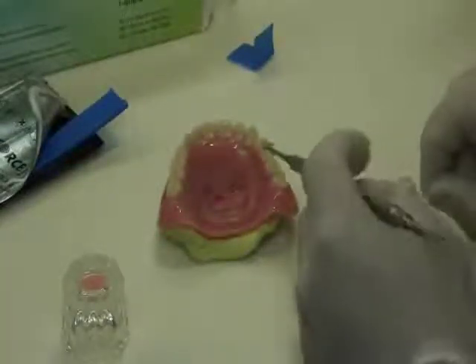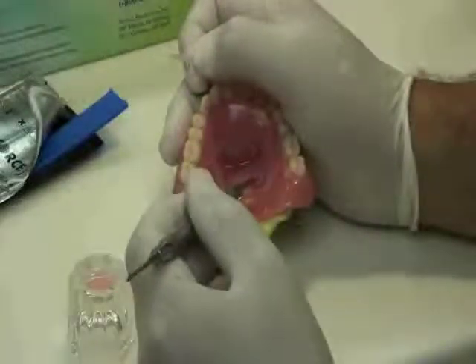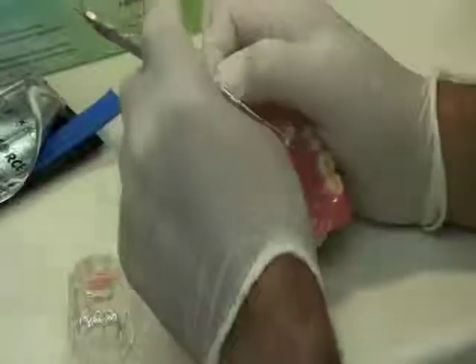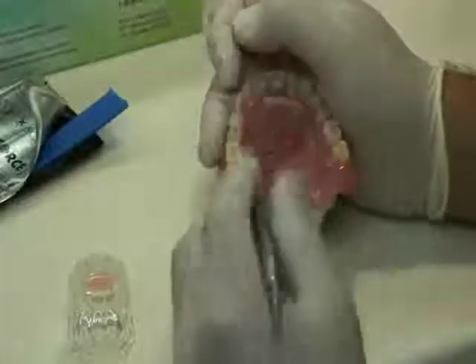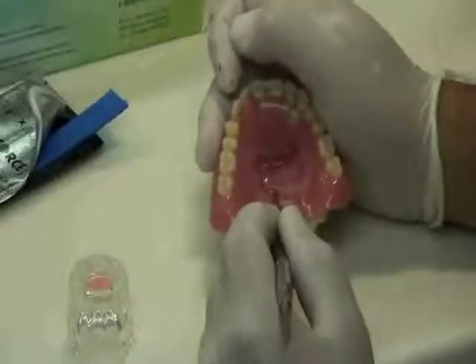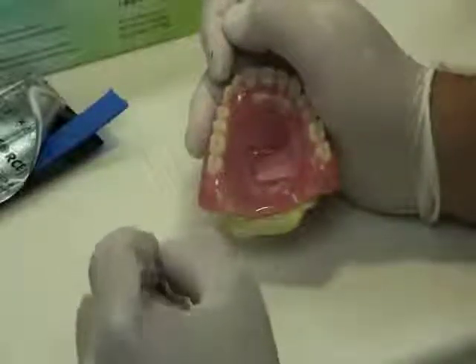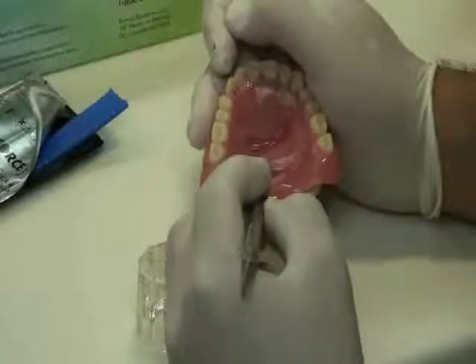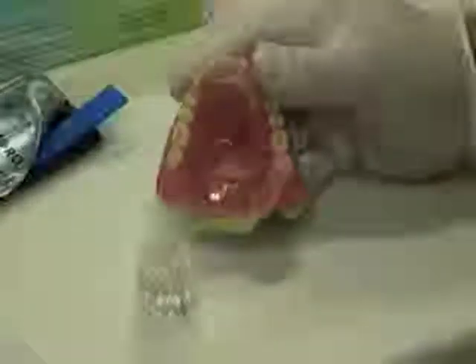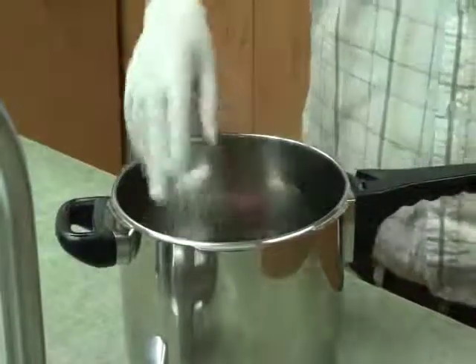The next step is to place the repair acrylic at the base of the space. This ensures that the Fiber Force is fully surrounded in acrylic and that no voids are created in the repair. Now take the cured Fiber Force and place it back into the space, then completely cover the material with repair acrylic. From this point, proceed as with any conventional repair by placing the appliance in the pressure pot. Once cured, simply trim and polish and you're done.